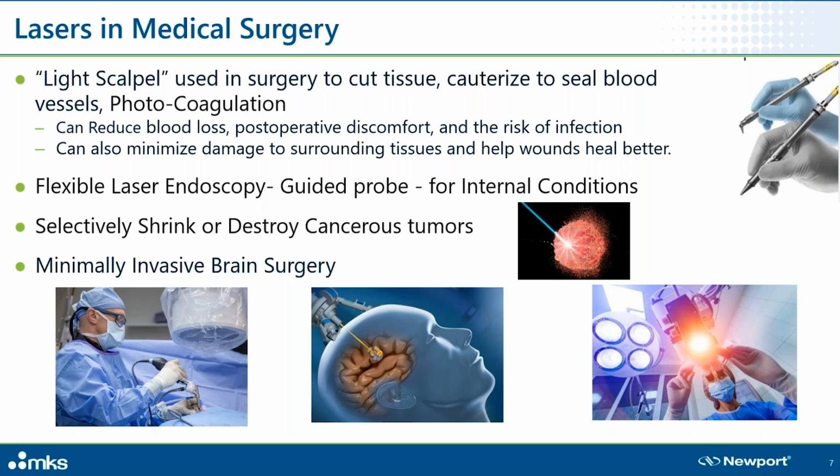In neurosurgery, the unresectable glioma used to be a dirty word. In other words, an inoperable brain tumor. That used to be a death sentence. Today, not so much. The advancements in laser technology have given patients a chance at life. Now we can directly target areas inside the brain without having to cut or drill a hole in the skull. Monteris has developed a technology called NeuroBlade, minimally invasive robotic laser thermotherapy that uses MRI-guided surgical ablation. Really cool stuff.